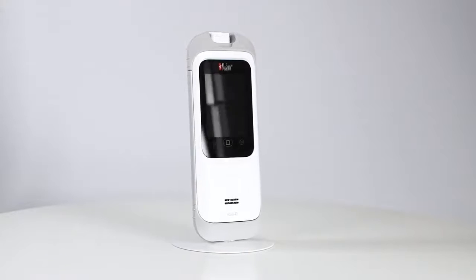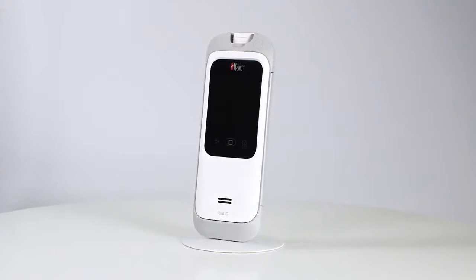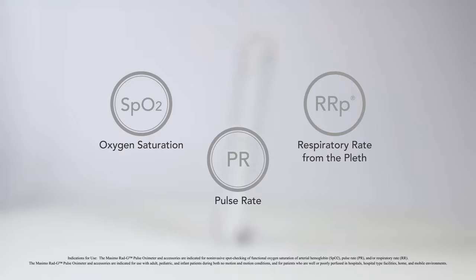The Massimo RadG is a hand-held fingertip pulse oximeter that enables non-invasive spot checking of functional oxygen saturation of arterial haemoglobin, SpO2, pulse rate, PR, and respiratory rate, RR.